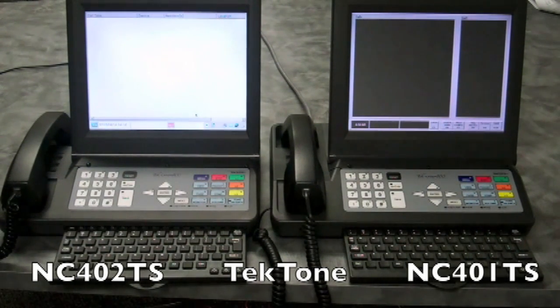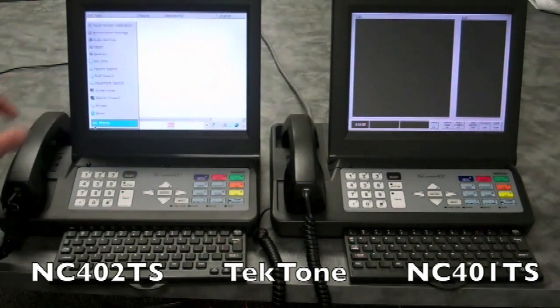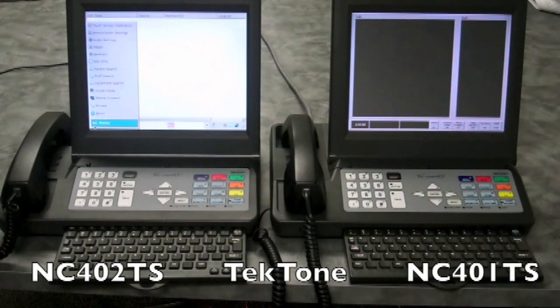The menu screen has been redesigned to provide access to more common features. The text message screen now displays multiple options simultaneously without the need to scroll up and down throughout the system.